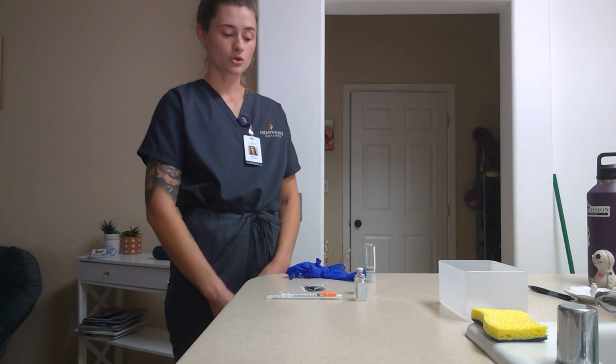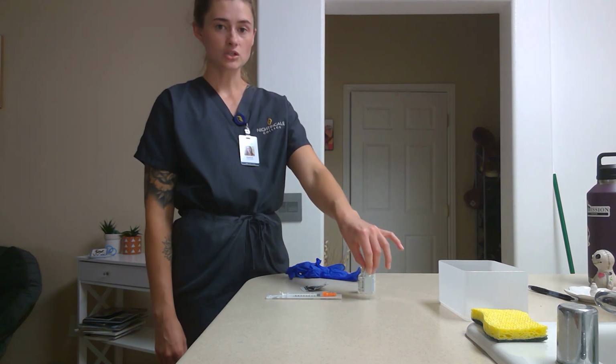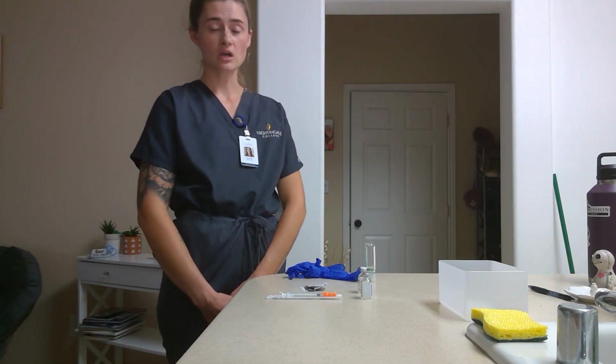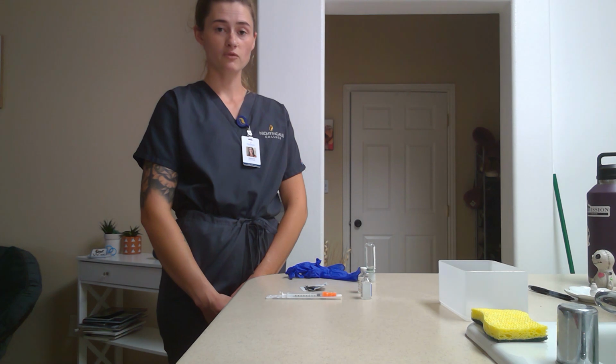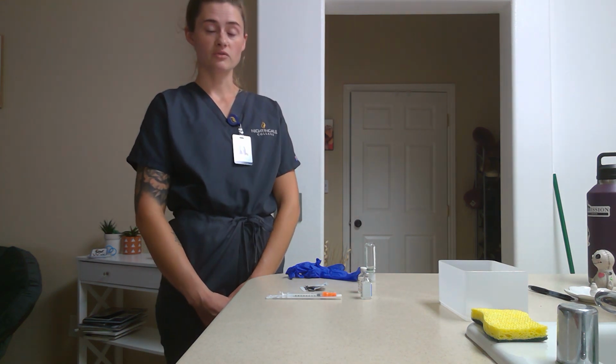So today the order is for 4 units of regular insulin and 8 units of NPH. We're going to be mixing them for today, and it's going to be injected subcutaneously into the abdomen. After I have verified all of that, the order also says that this medication is to be given before breakfast, so we'll be giving it before the meal. And once that is verified, I'm going to provide privacy.